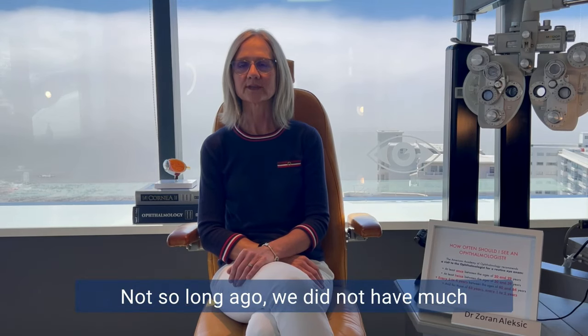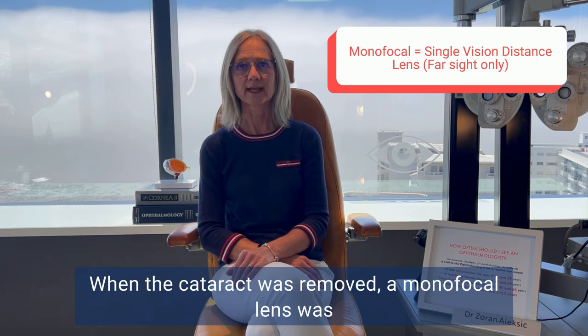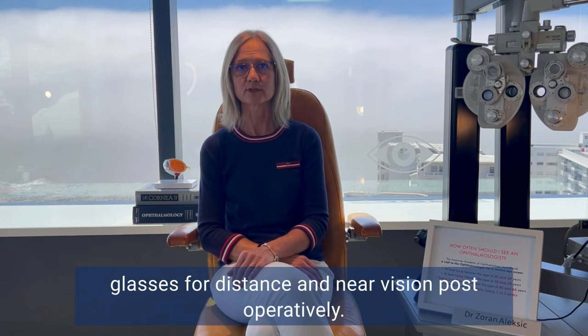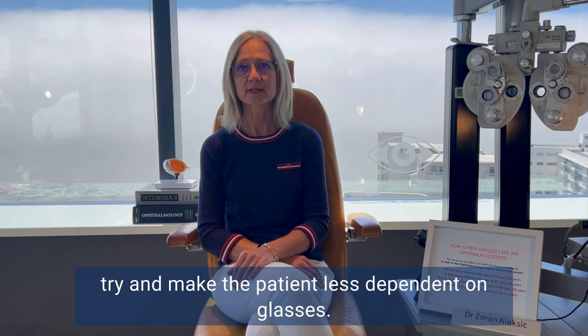Not so long ago, we did not have much of a choice when it came to cataract surgery. When the cataract was removed, a monofocal lens was implanted, and most people were still totally dependent on glasses for distance and near vision postoperatively. Nowadays, there are a number of options available to try and make the patient less dependent on glasses.